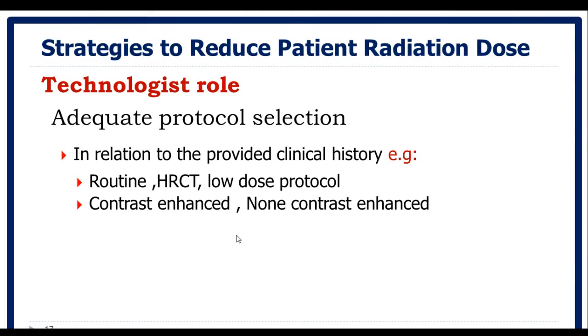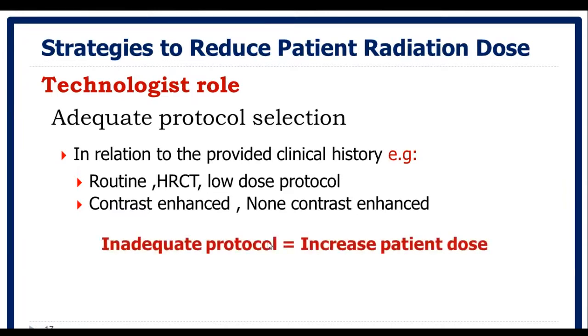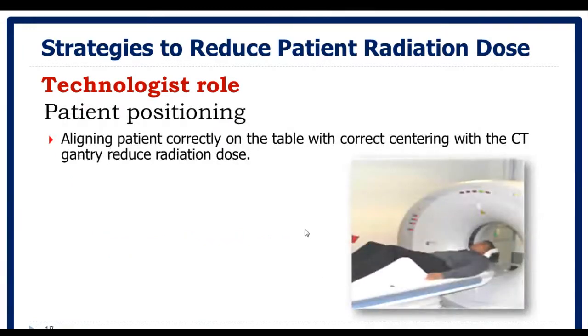And if there is insufficient requisition data, we need to confirm the real purpose of this exam rather than just imaging the patient, and we may find that we are selecting the incorrect protocol. So inadequate protocol also increases the patient dose.